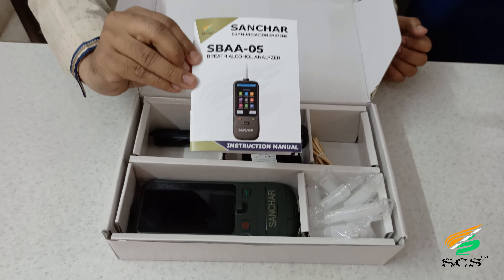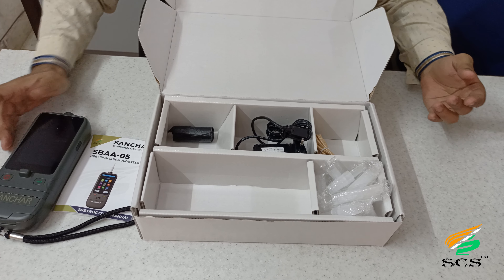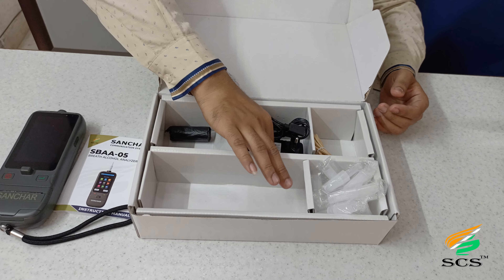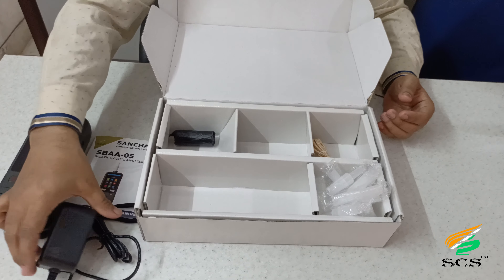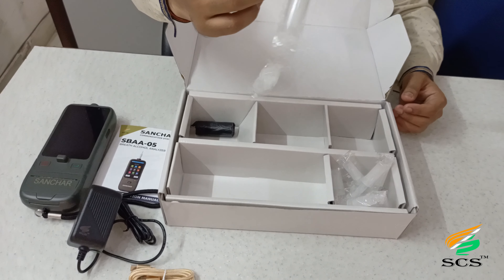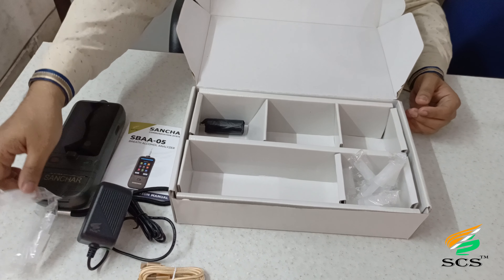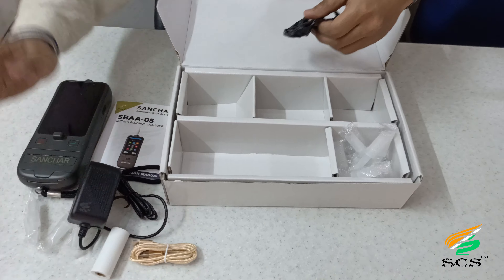As soon as you open the box, you will see the instruction manual. This is the Sanchar Breath Alcohol Analyzer 05. You get other accessories like a charging adapter, USB cable, mouthpiece, and thermal roll.